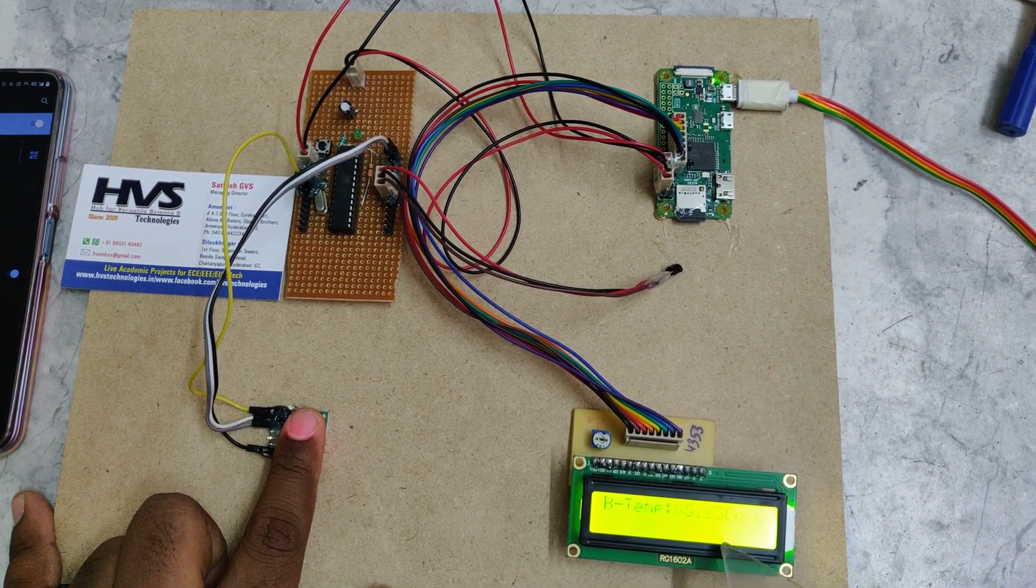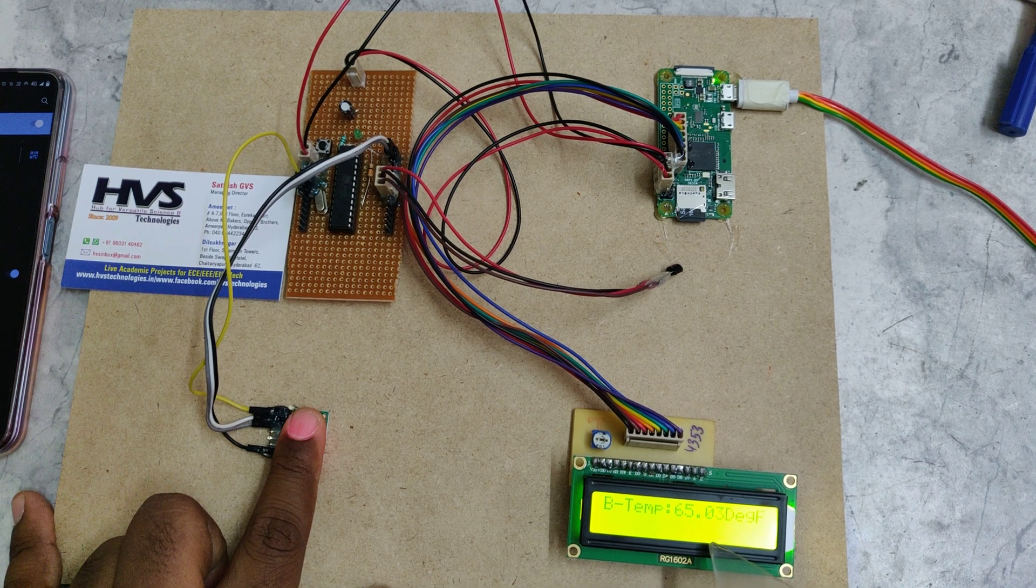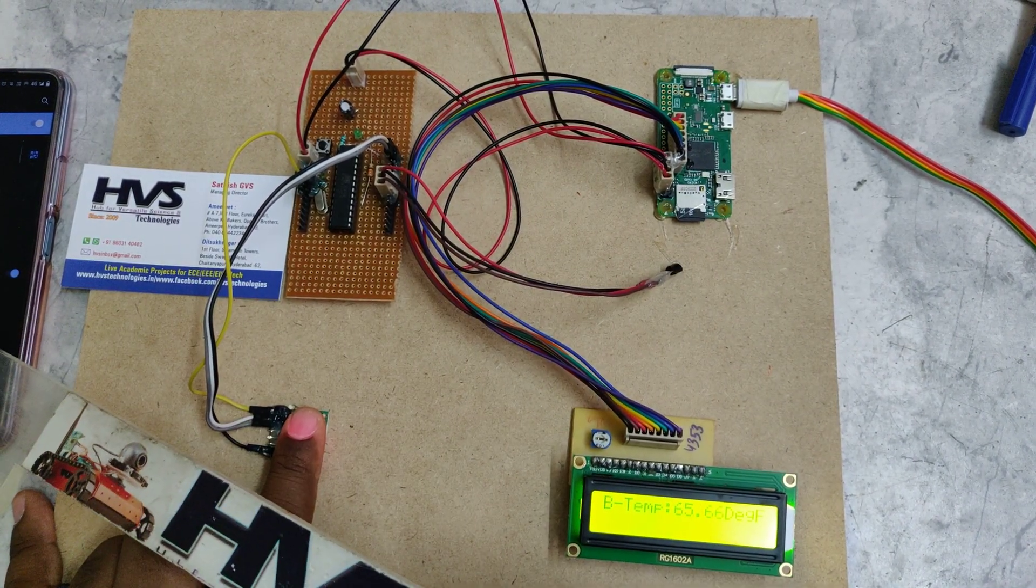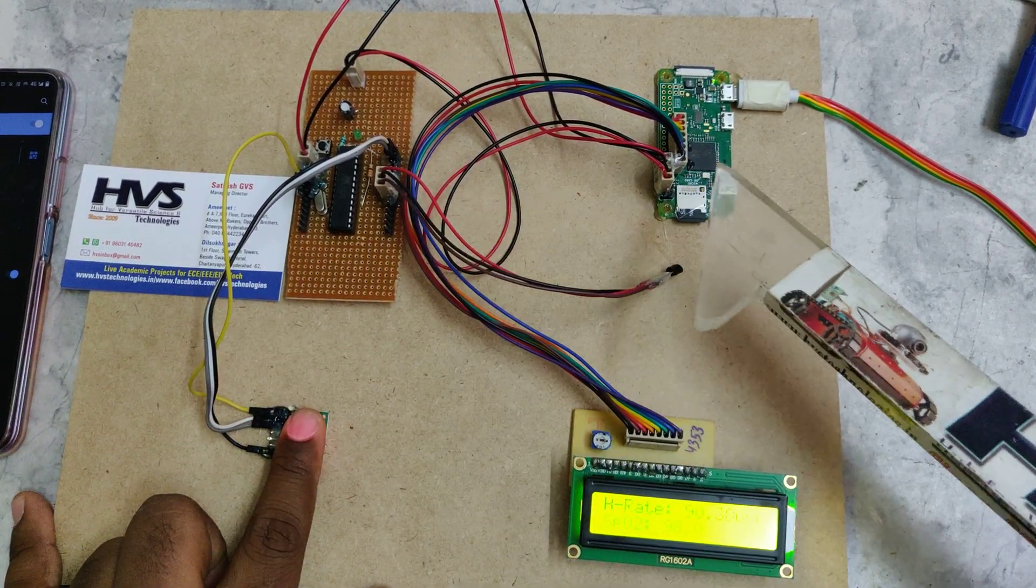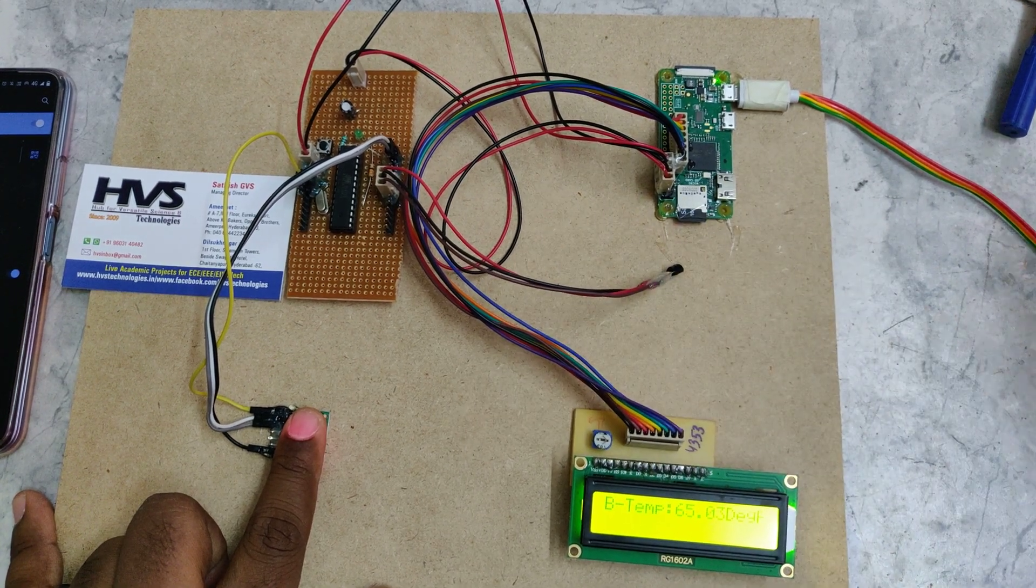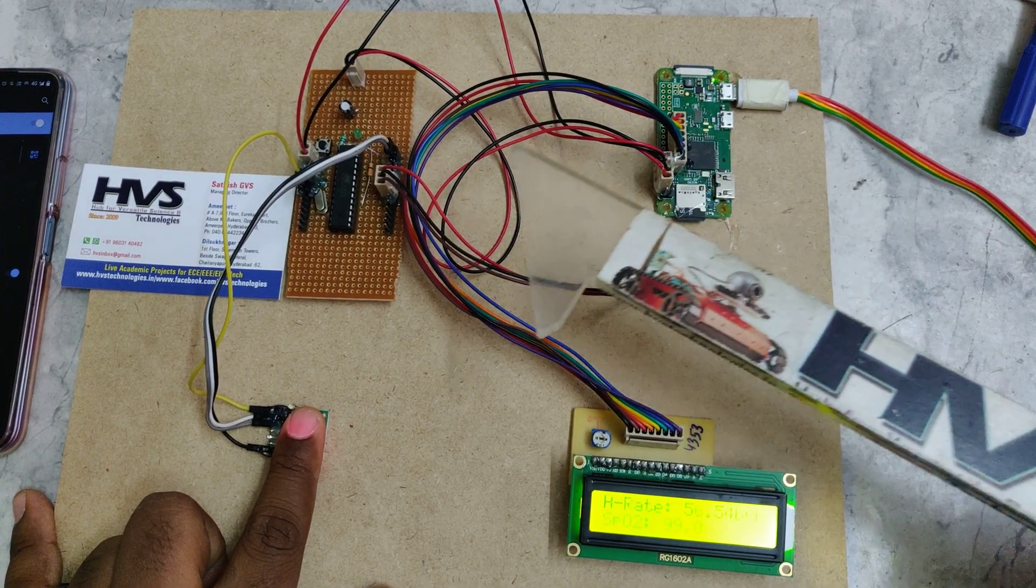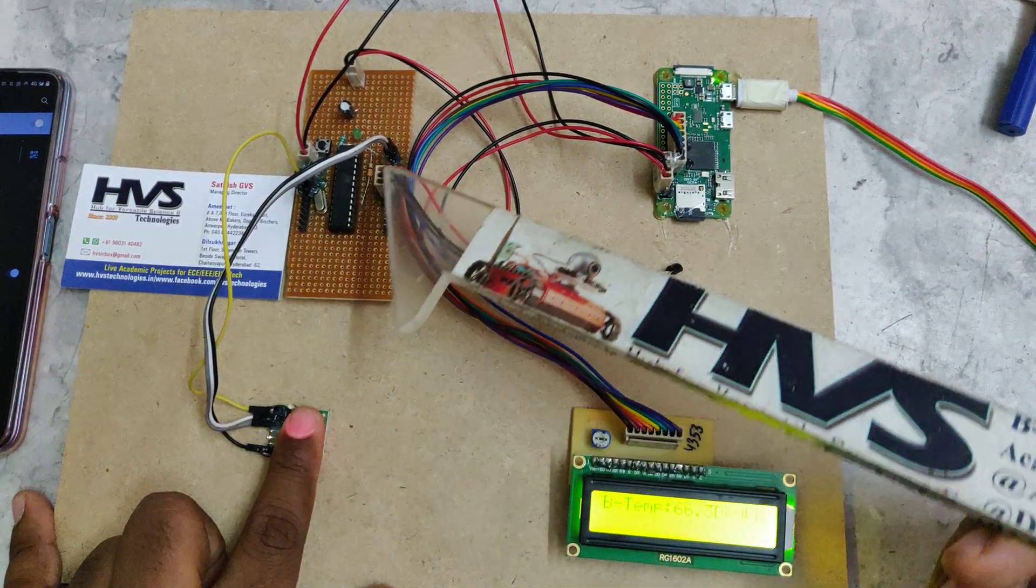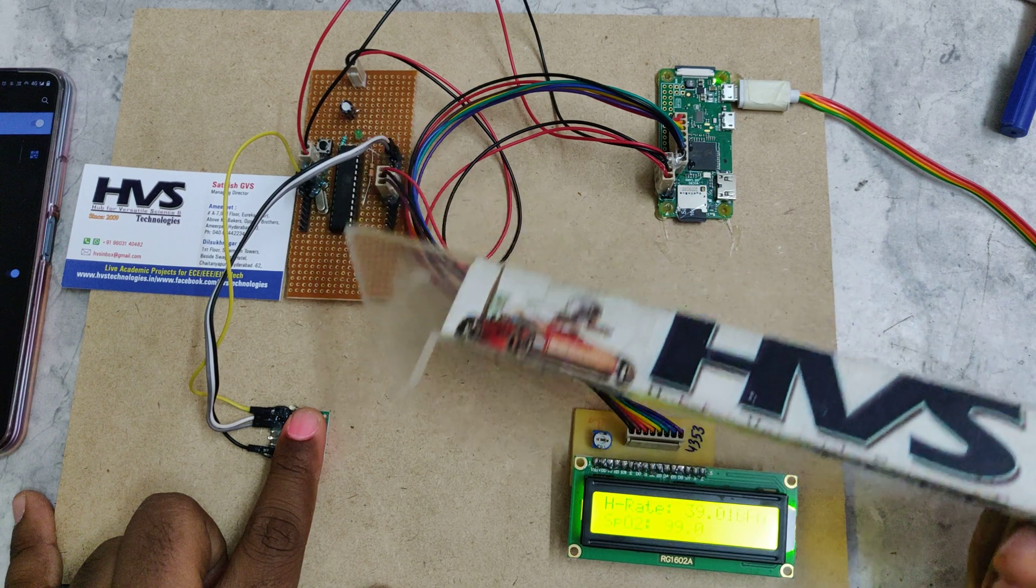You can see the parameters like the heart rate, SpO2, and temperature. Through the phone internet, the Raspberry Pi will send the data to ThingSpeak.